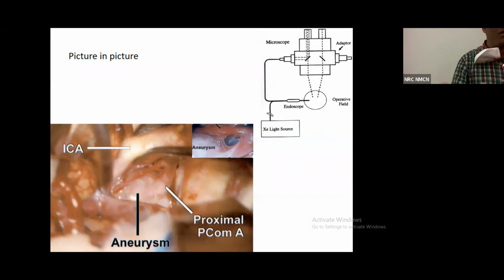Normal brain parenchyma might escape the injury, but the blood vessels and the nerves might get damaged. So it automatically reduces the intensity of the light. That is why we never use 100% light intensity, and that is why we never use 21x magnification, because the injury to the brain parenchyma, for whatever surgery you are using it, might be pretty high.